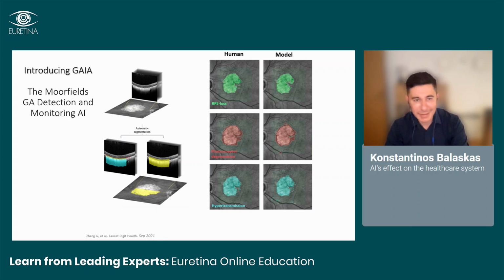It also means Earth in Greek. And so this model, which is currently functional on Heidelberg OCTs, segments every single B scan of a Heidelberg OCT volume for the three features that are determined by the CAM consensus definitions as required to define the presence of geographic atrophy, or RORA, as they like to use these a bit more esoteric terms.